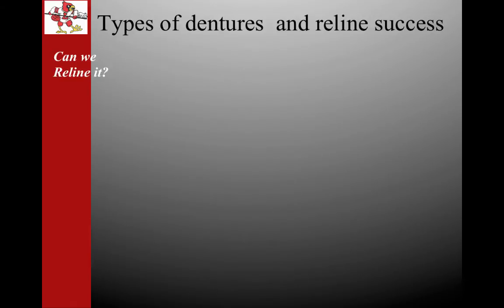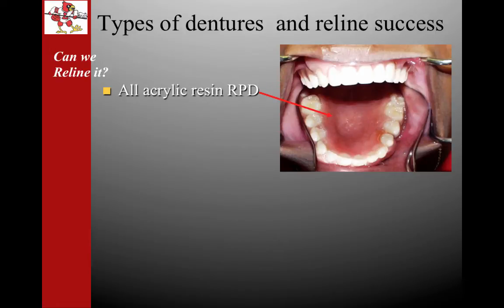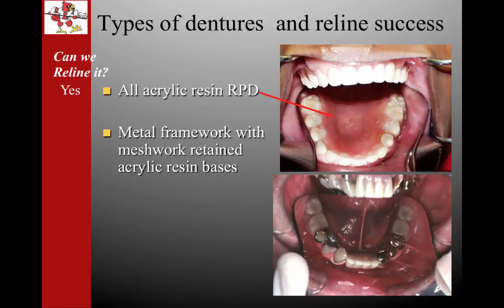There are various types of removable partial dentures, and they respond differently to relining procedures. The all-acrylic removable partial denture, like the temporary denture, can easily be relined. Partial dentures with a metal framework in them are conducive to the reline procedure in the areas where there's base attachment and acrylic resin. The metal area of the framework cannot be relined. This would also apply to areas like facings, tube teeth, and metal teeth.